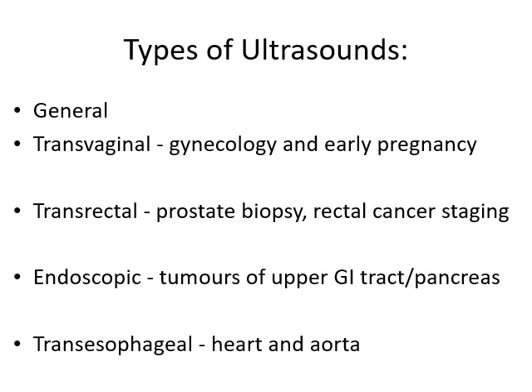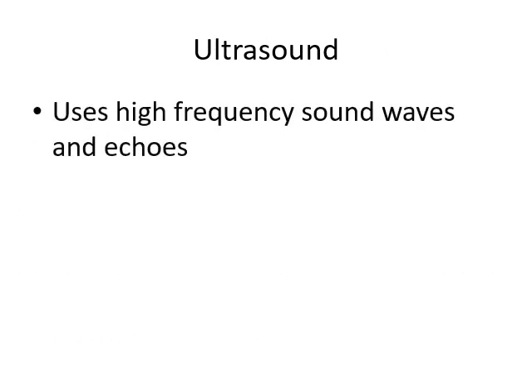All right, so basically ultrasounds, what are they? An ultrasound is basically using high frequency sound waves and echoes. This is a technology that only kind of came into effect after the Second World War, but they were using the technology long before that in the military field, looking at U-boats under the water. They were sending out sound waves and then they'd bounce back, and then they could get an idea of how deep the U-boats were and what their position was. So it's basically doing the exact same thing.